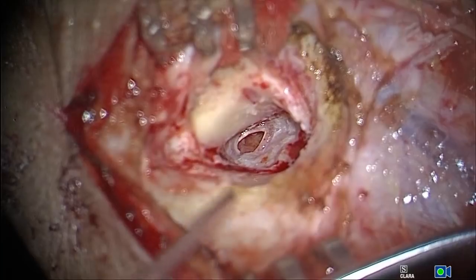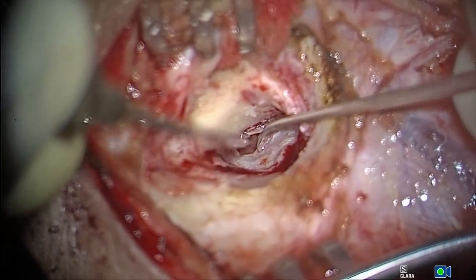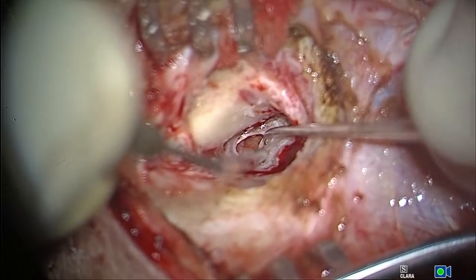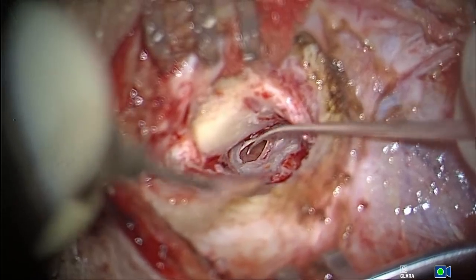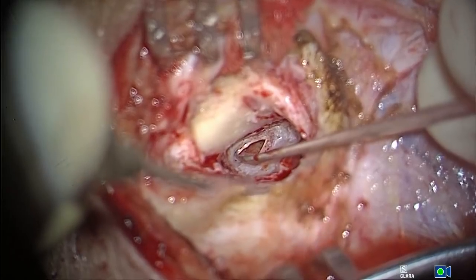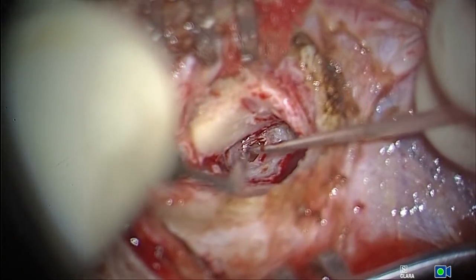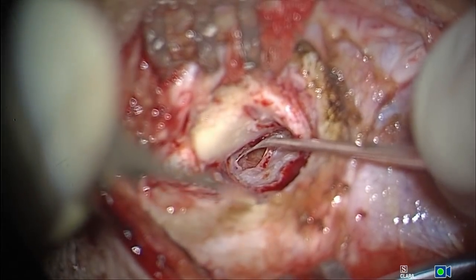Hockey. So this is the instrument I use, the hockey stick. And what I do is I make multiple small holes. And I try to maintain that flap, this is called the flap length, anterior flap length. I really love to have that anterior flap length.